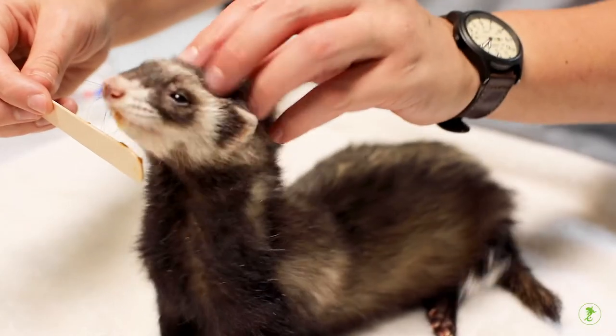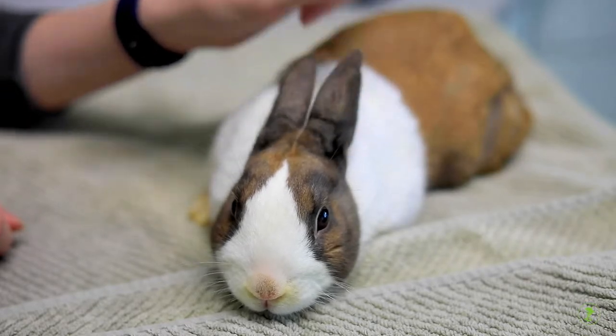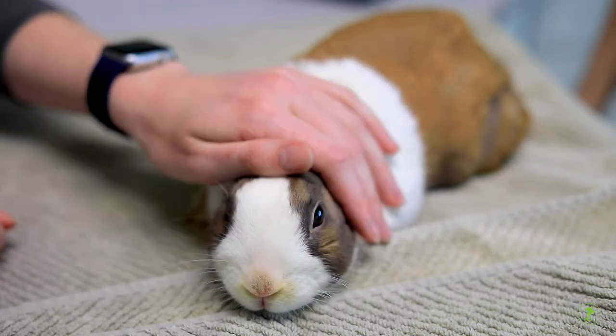Your veterinarian can discuss normal values expected for your particular pet and what to do if the temperature is abnormal.